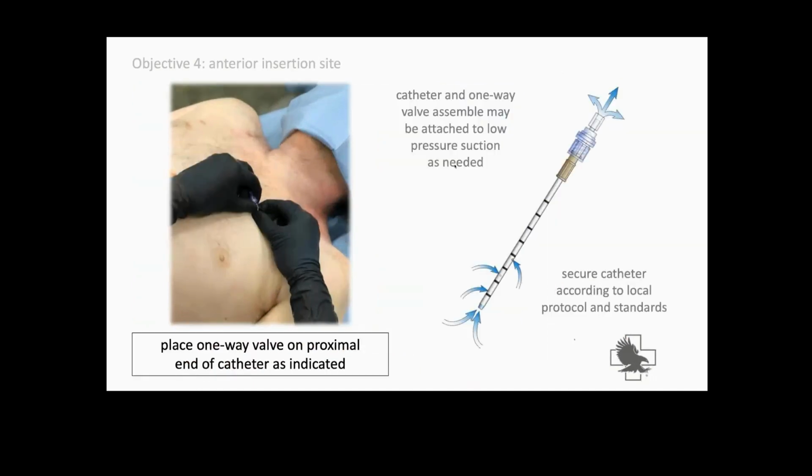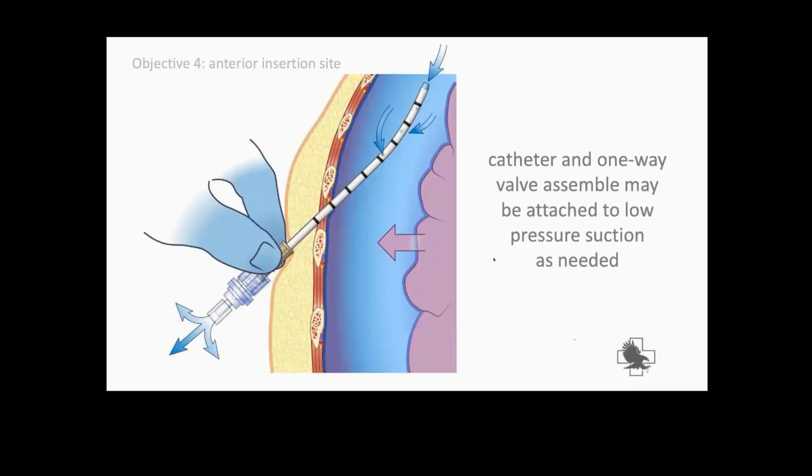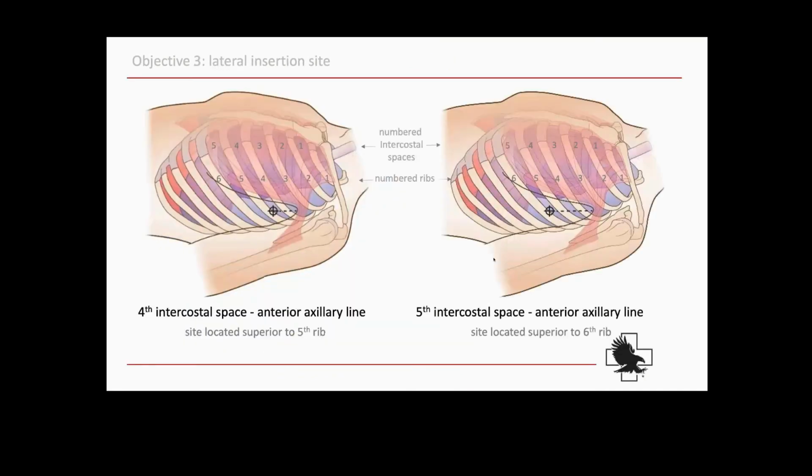And then from there, they're just showing here the way the catheter works. Once again, it's not just pulling air from the tip, the distal tip of the catheter is actually pulling air from these fenestrations as well. So if the tip is touching something or blocked by some sort of tissue or blood clot, it's actually still going to have some functionality through these fenestrations. This is the way in which I kind of joke that it's like a mini chest tube, not only in size, but in character and having those fenestrations. Here's just a diagram of it in place. Once again, how it's going to pull air from that pleural space through different routes, and that it's using a one-way valve that's designed for this device, not putting a glove over it or some of the other things that we've done in the past.